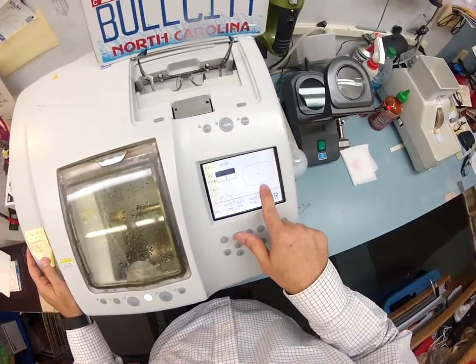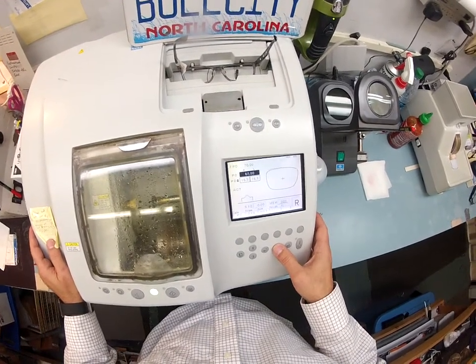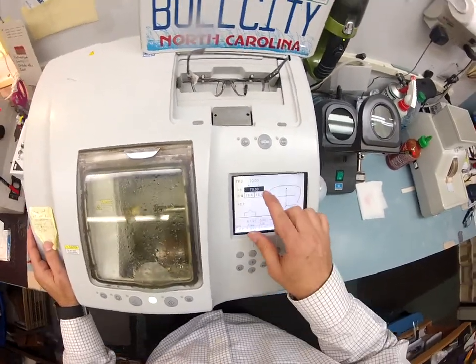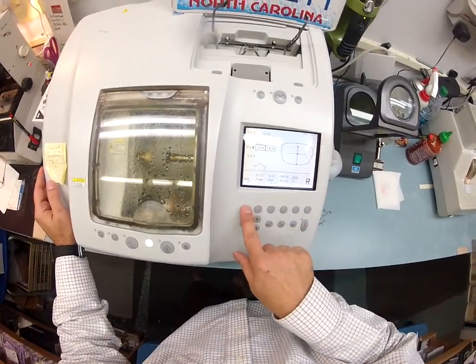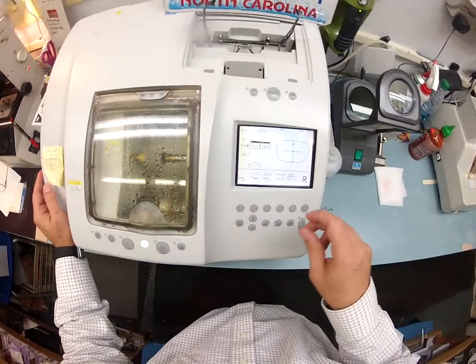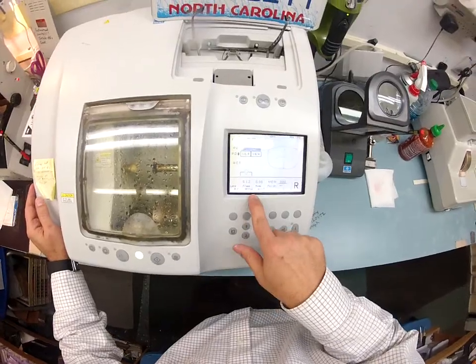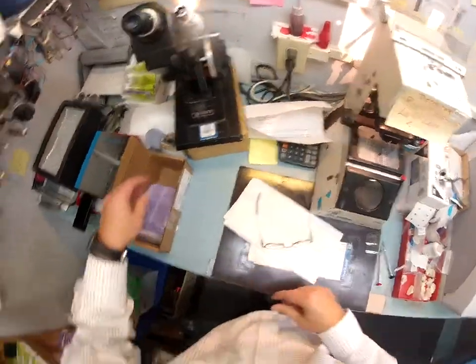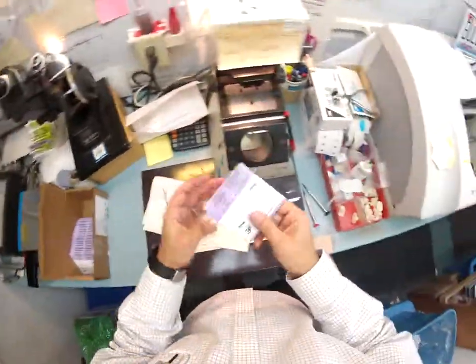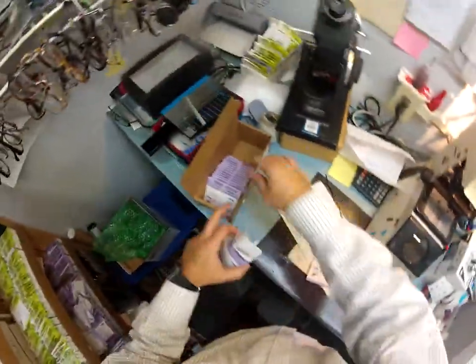I'm going to pull this shape up and match the pupillary distance. For a prescription I would type this in, but this is a non-prescription lens, so I just have it match the frame. This is a polycarbonate lens that I'm going to cut on the soft cycle because of the anti-glare coating. When I first ordered from you I was running low on lenses, so I went out and bought another 20 pairs.